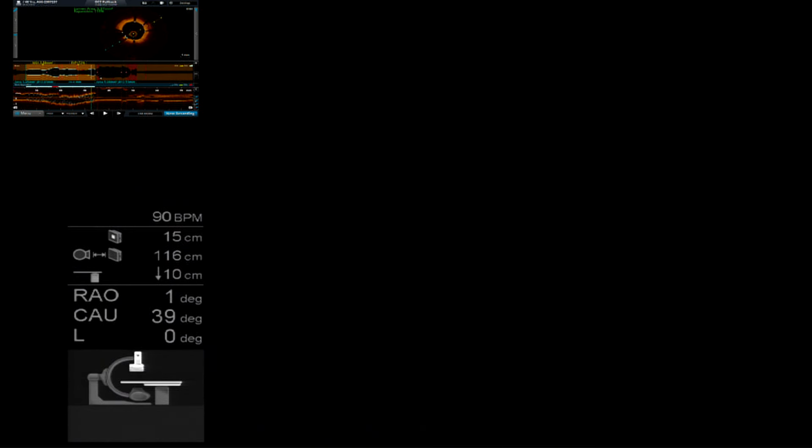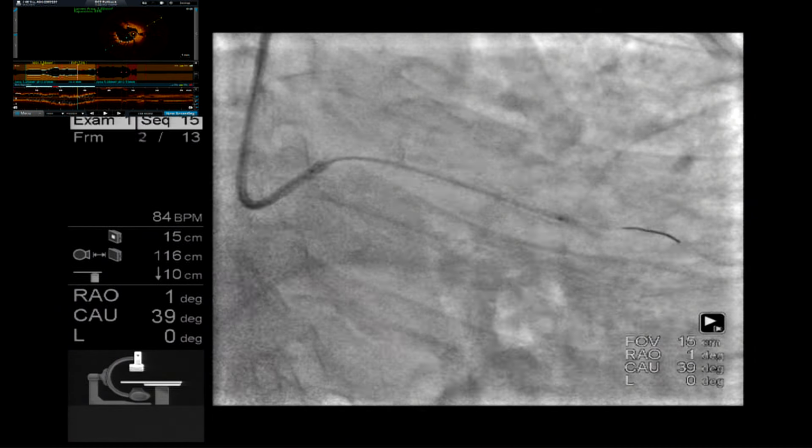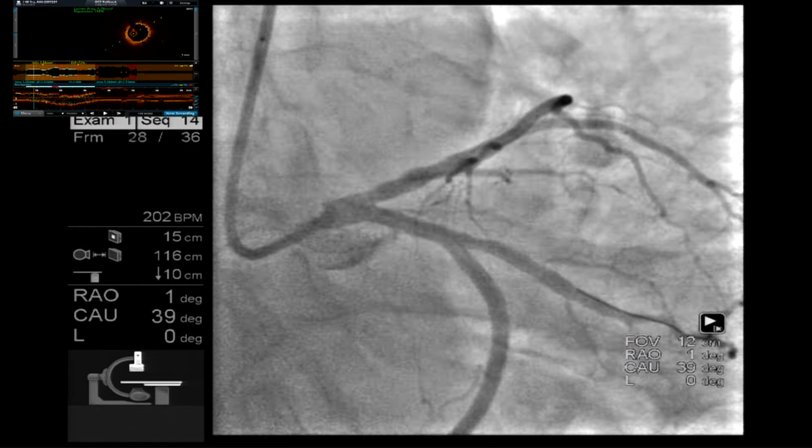Sir, I have one question. With your experience, there was amazing ostial stenting that was absolutely perfect. In some cases, when we find it difficult to place ostially, what are your views about keeping a balloon in the main vessel, inflating and pulling back the stent so that there is an indentation, the balloon-assisted technique for ostial stenting? So the question was, would you inflate a balloon in the main branch to nail the ostium in the side branch with a stent? Samir, you answer and then I will answer that question. Not in this case. This case was amazing.